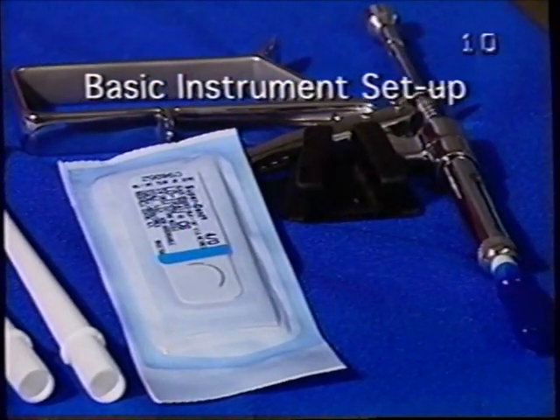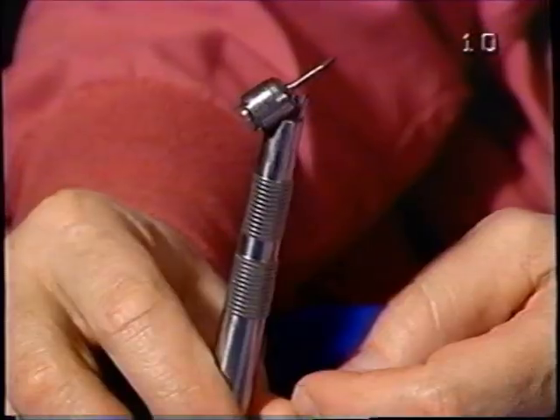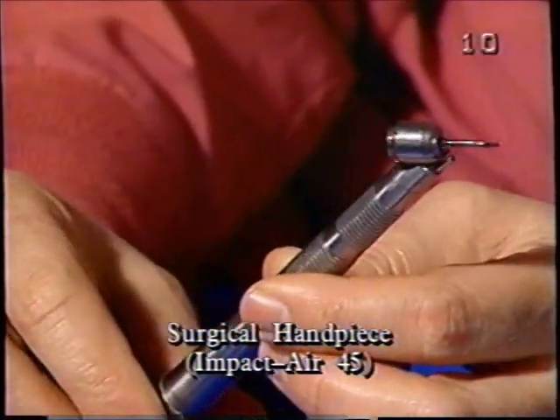Even if it's a so-called simple extraction, these are the instruments we have ready. The first instrument that I want to show is the surgical high-speed handpiece.